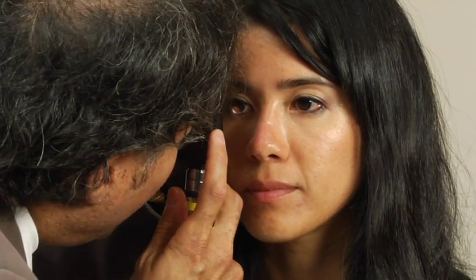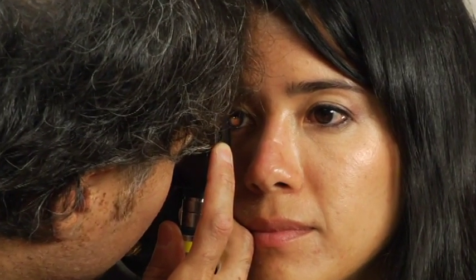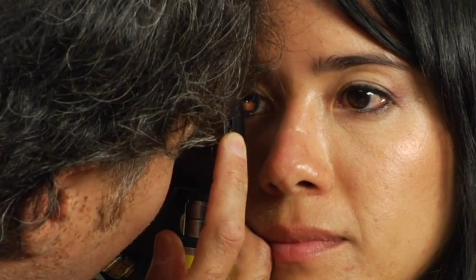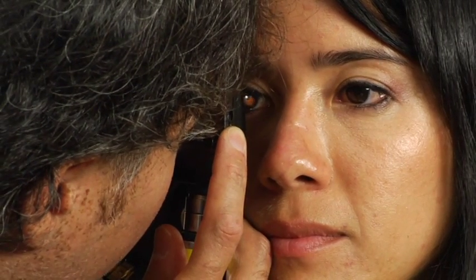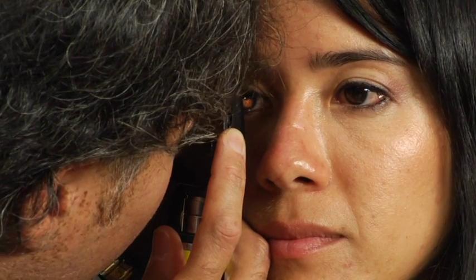Very good. So Dr. Zhao, please look straight ahead. I will then begin by looking for the red reflex. Once I've found it, I will work my way in, and I will first try to visualize the optic nerve. And the optic nerve is going to be located just slightly nasal to the center axis of the vision. And once I locate the optic nerve, I'm looking at the color of the optic nerve to determine whether it's a orangey pink color. If there's any pallor, that could indicate an optic nerve problem.